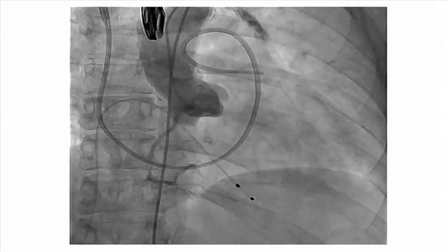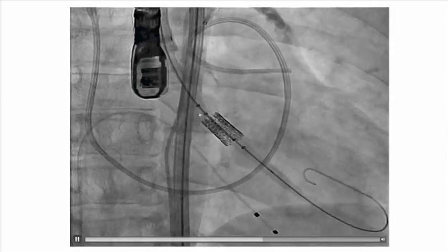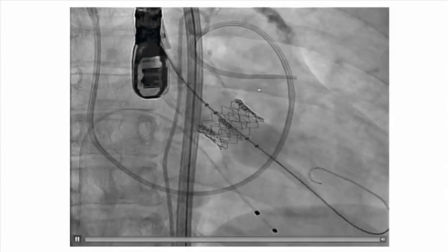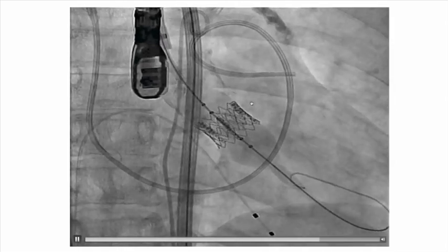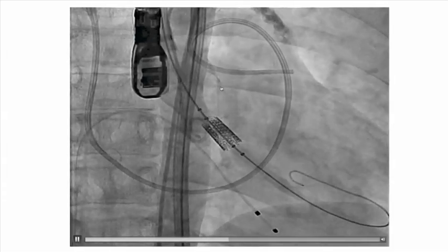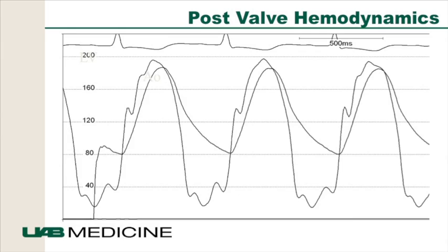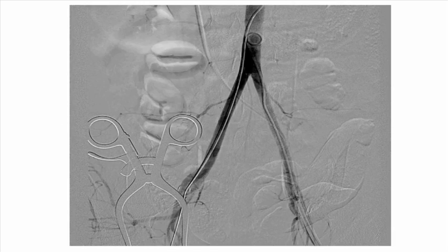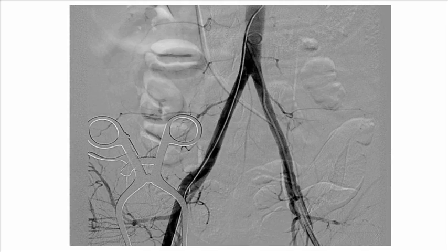The aortogram is performed and we confirm the position of the valve cusps. This is the valve being delivered via a transfemoral approach going around the aorta — it's a balloon-expandable valve deployed under rapid ventricular pacing. We make adjustments to the position and the valve is subsequently deployed. We then check for paravalvular leak, check for valve function, and make sure the coronaries are ostia-free. Here is post-valve hemodynamics showing minimal gradients between the left ventricle and aorta. We perform a final aorto-iliac angiography to confirm no trauma to the iliofemoral system, then close the groin and extubate the patient.